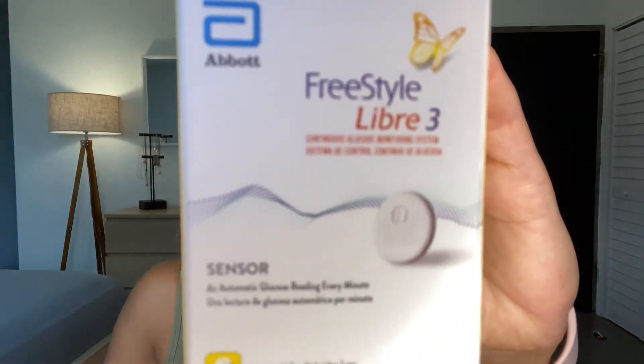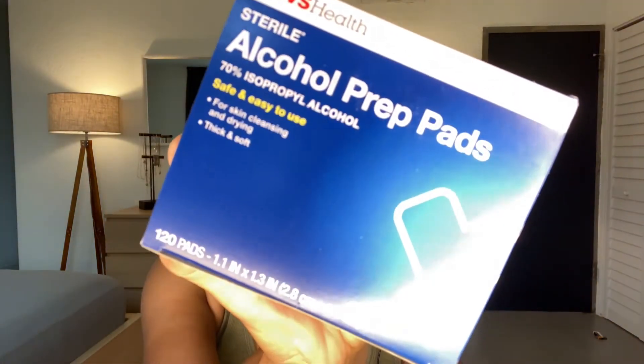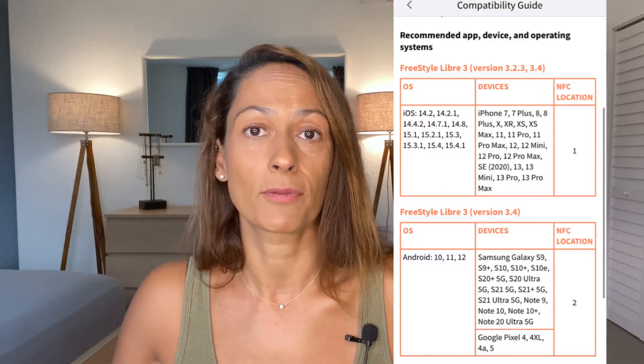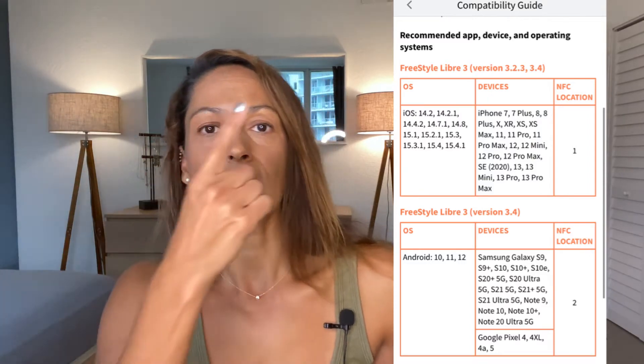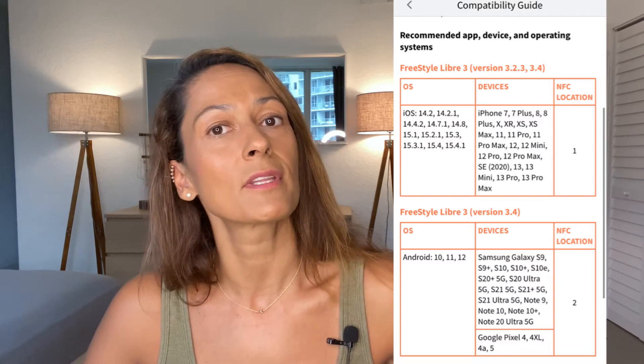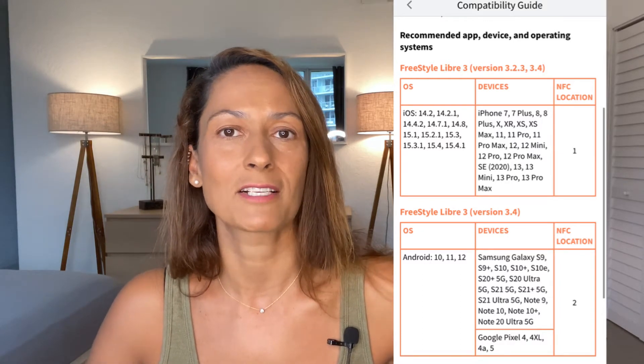Before you get started, make sure that you have at least one Freestyle Libre 3 sensor, alcohol swabs or something similar to clean your skin with, and that your smartphone is compatible with the Freestyle Libre 3 sensor. You can see all the compatible smart devices listed, so look through the list and make sure your device is compatible.